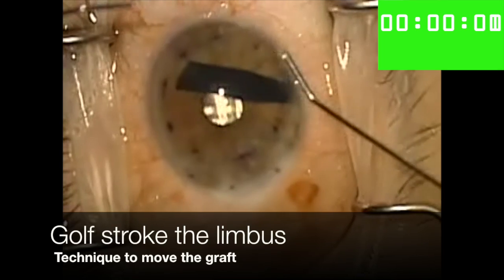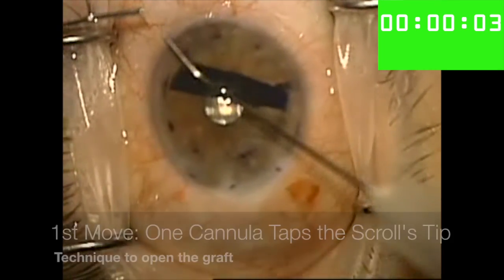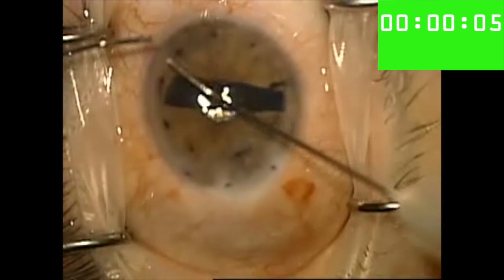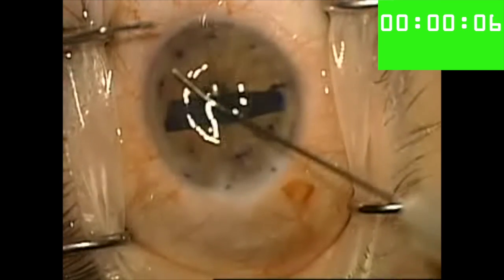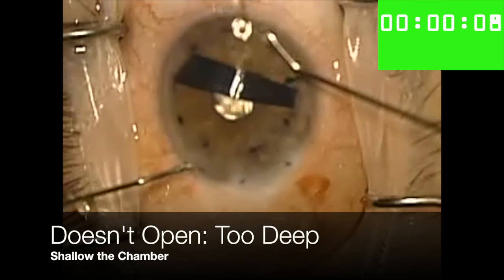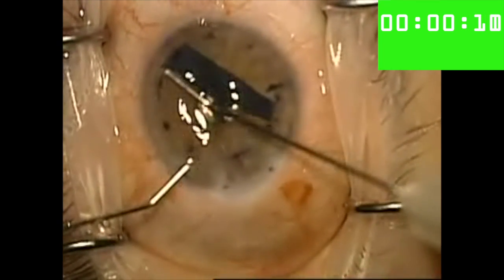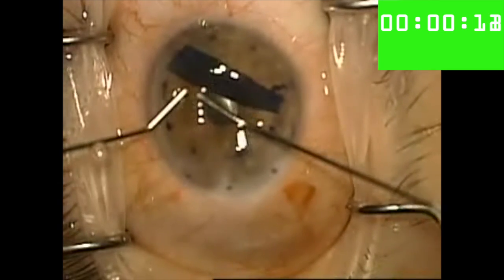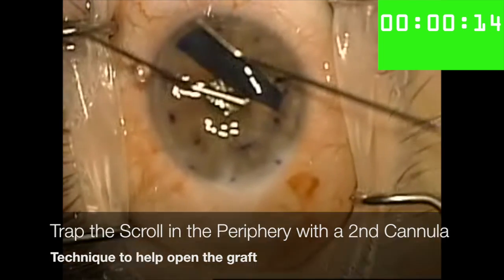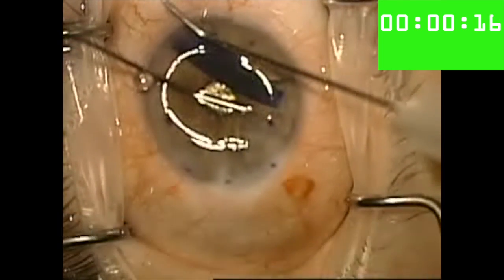Here's a golf stroke of the limbus that moves the scroll towards the center of the anterior chamber. My opening move is then to take one cannula and to tap at one end of the scroll. I then nudge the scroll up towards the area of the anterior chamber that I want to open it in, and I shallow the chamber because it's too deep. Here's a technique to trap the scroll in a shallower part of the anterior chamber with one cannula while using the other cannula to tap one end of the scroll to start opening it.